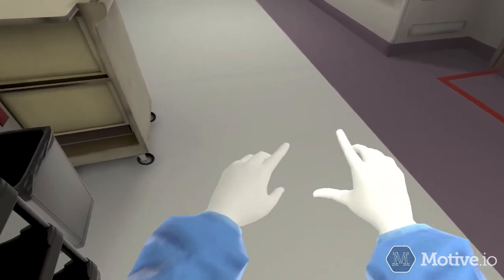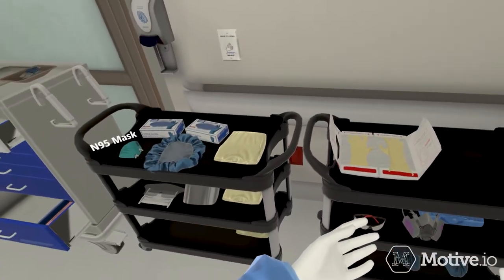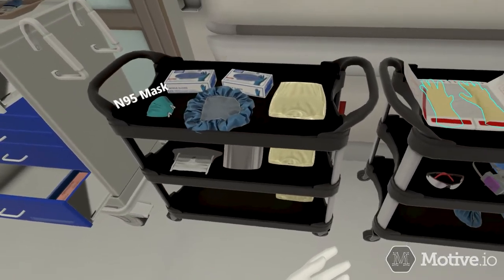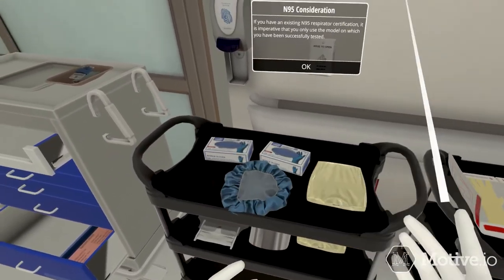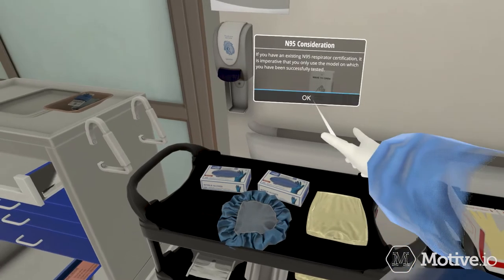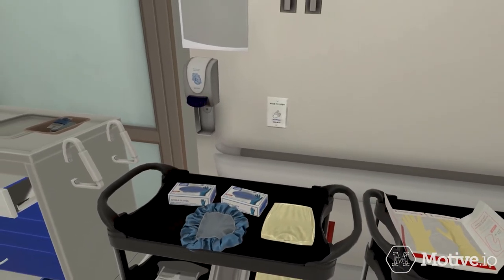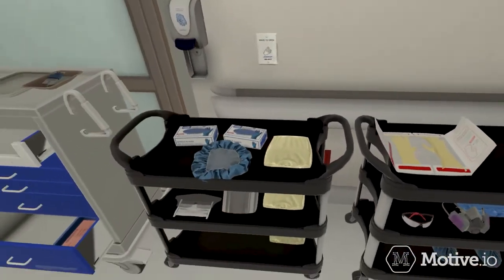Next, don a respirator. You can choose either an N95 mask or a reusable respirator. If you have an existing N95 respirator certification, it is imperative that you only use the model on which you have been successfully tested. Complete a fit and seal test each time you don the respirator.